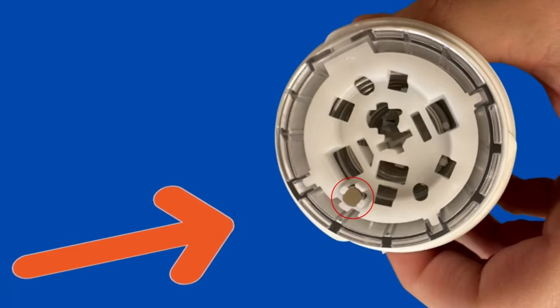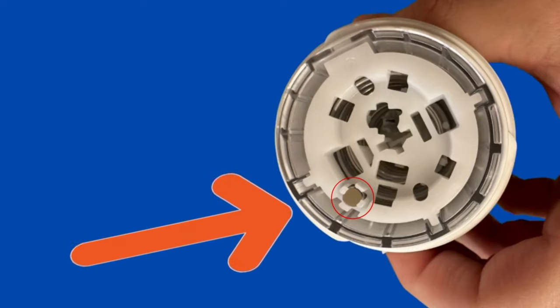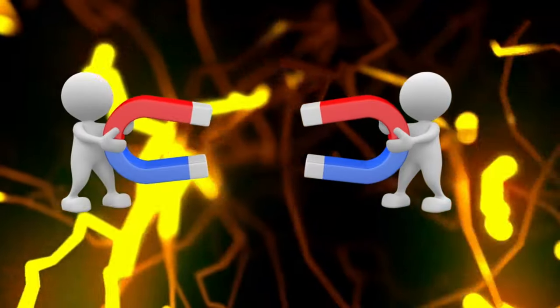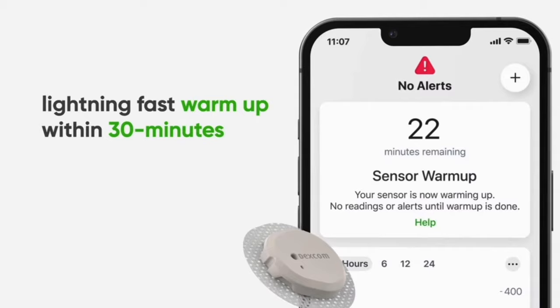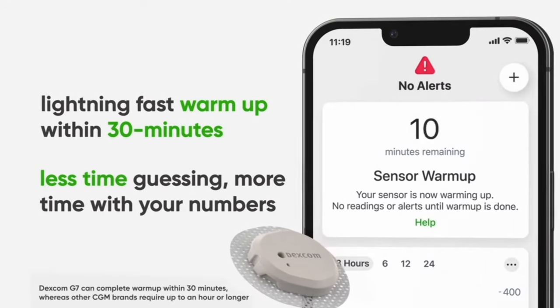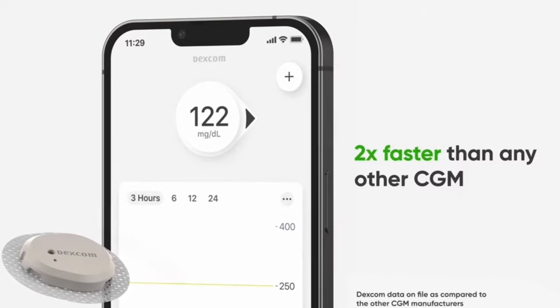But with the new Dexcom G7, it actually has a little magnet that's built into both the sensor applicator and the sensor itself. Once those two magnets are separated, the sensor automatically starts and your 30-minute warmup process begins. That's right — the Dexcom G7 only has a 30-minute warmup time, which is down from two hours with the G6.